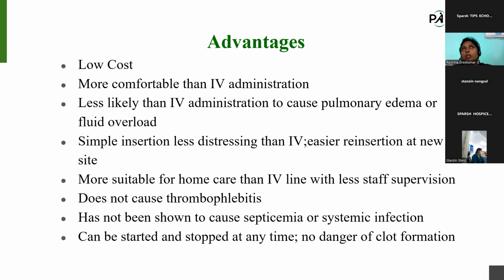Because here we are only giving 20 drops per minute, the chance of pulmonary edema or fluid overload is very rare in subcutaneous infusion. And it is very easy and simple to insert. Anyone can do this. And it is less distressing than IV, with easier reinsertion at new sites.